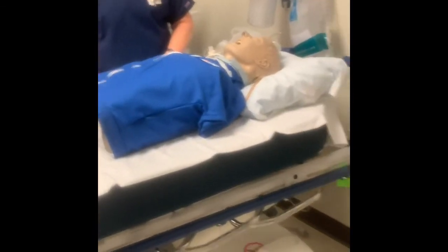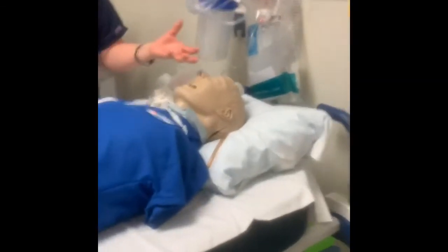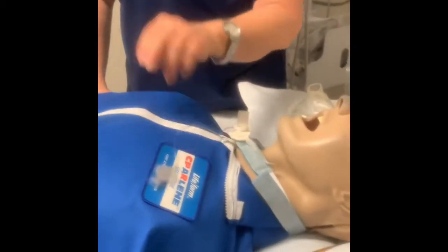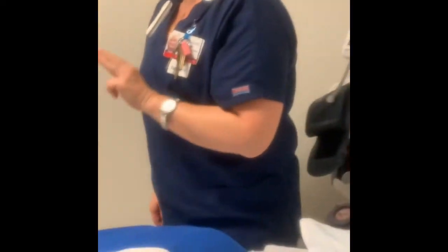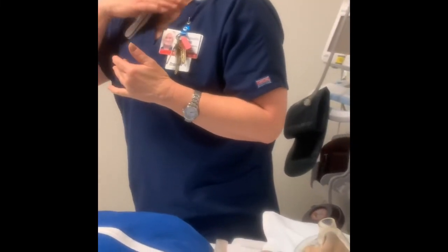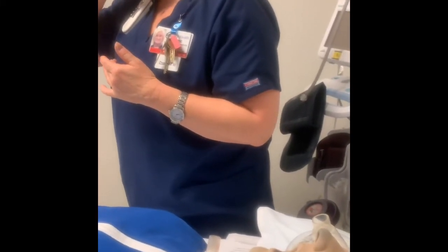So a couple things we're going to deal with here is, if you guys just want to pop up here a little bit closer, because I'm going to have you touch it, do whatever you want with it, okay? So we have three airways that we deal with here at Banner Gateway. One is a laryngectomy, and remember the larynx is above the trachea, okay?